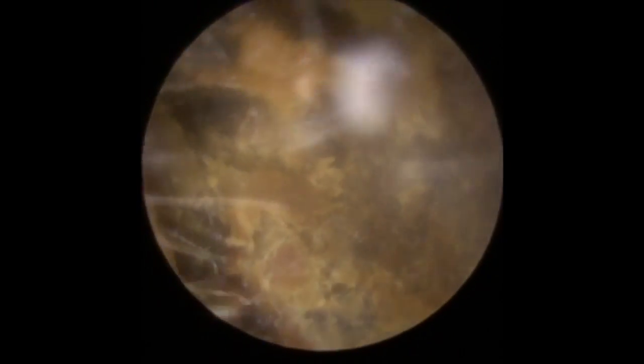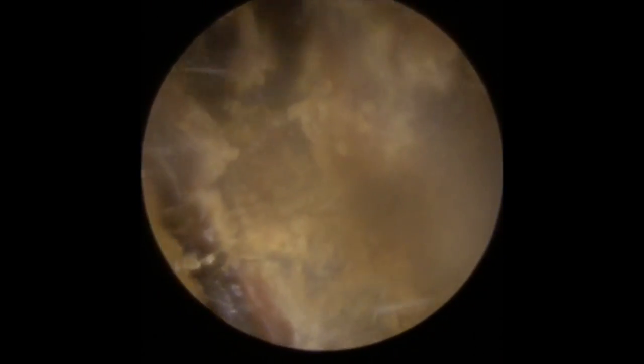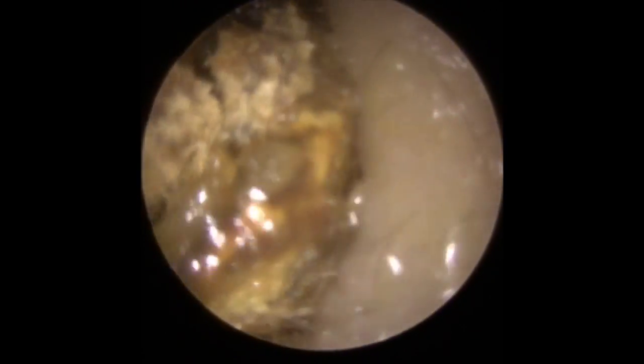Just getting a grip on the outside edge, not going in too deep — just trying to get a little bit of leverage, a little bit of purchase on this wax. But you can see it's just broken away the front section there. I'm trying to get above it but it's perfectly formed to the shape of the canal, so I'm trying to create almost a ledge in the wax to use as a lever to bring this out.